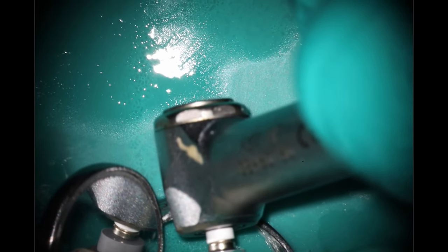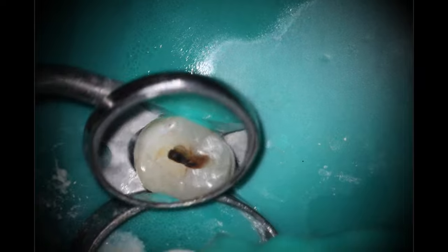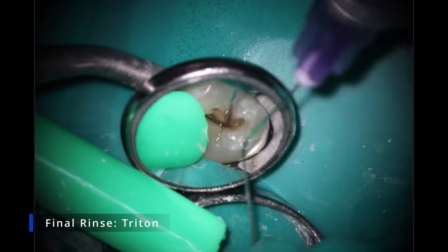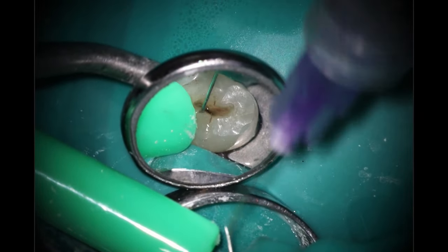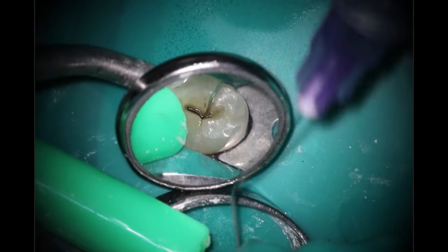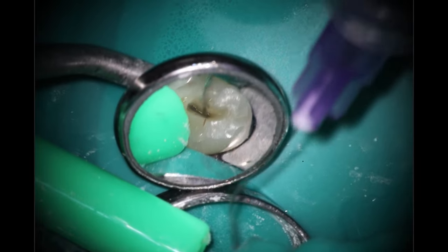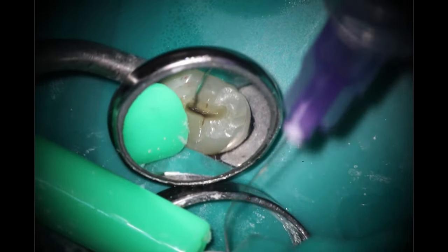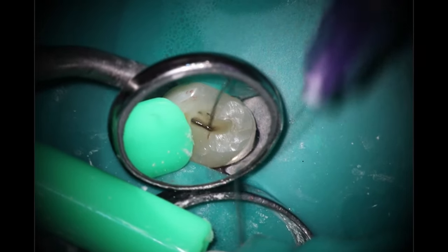Nothing too aggressive here — we want to keep things nice and conservative. I like to keep the initial shape as close to what nature gave us and don't want to really remove excess tooth structure. Now doing our final rinse here with the Triton, just rinsing it out until I don't see anything coming up. That's always a question — when do you finish rinsing? For me, it's once everything's nice and clean and we don't see any debris coming up and there's no more drainage. At that point I'm usually comfortable to fill.